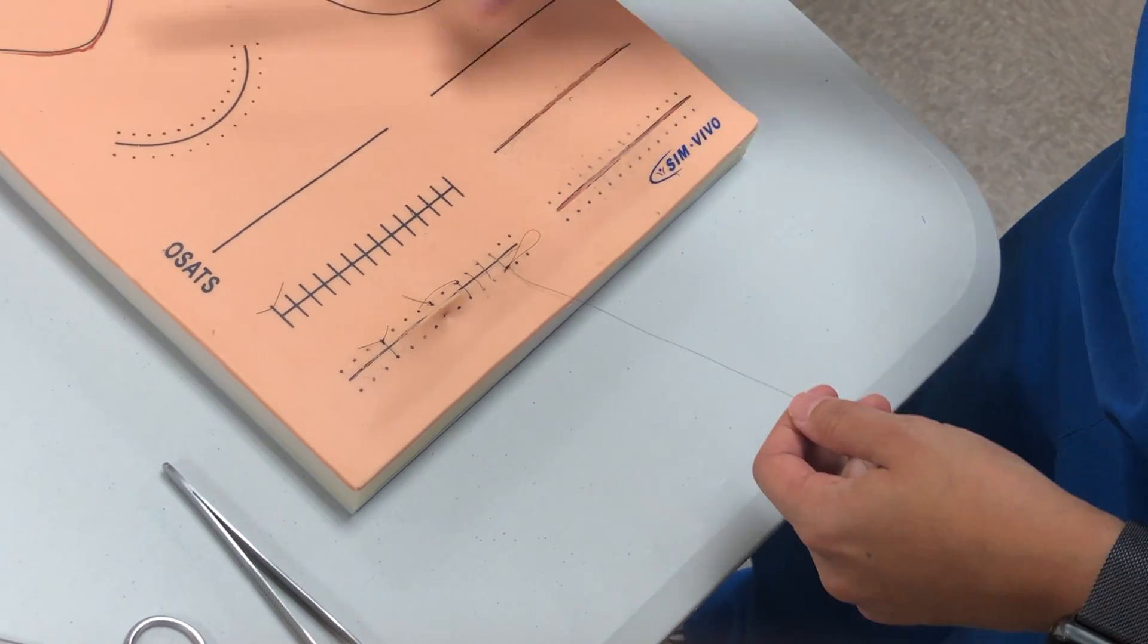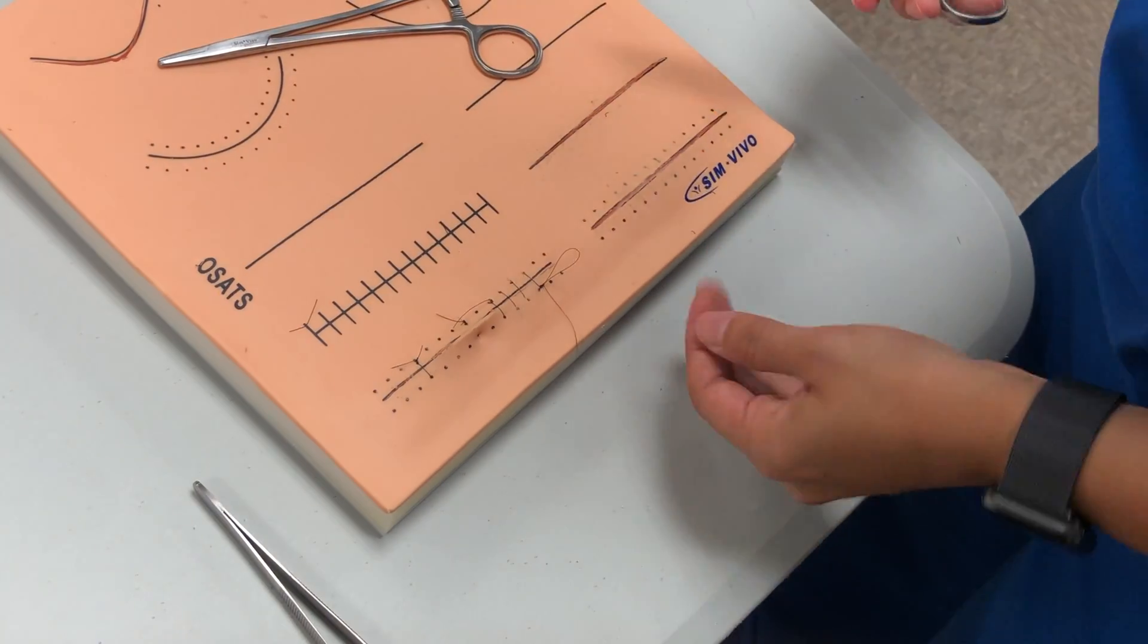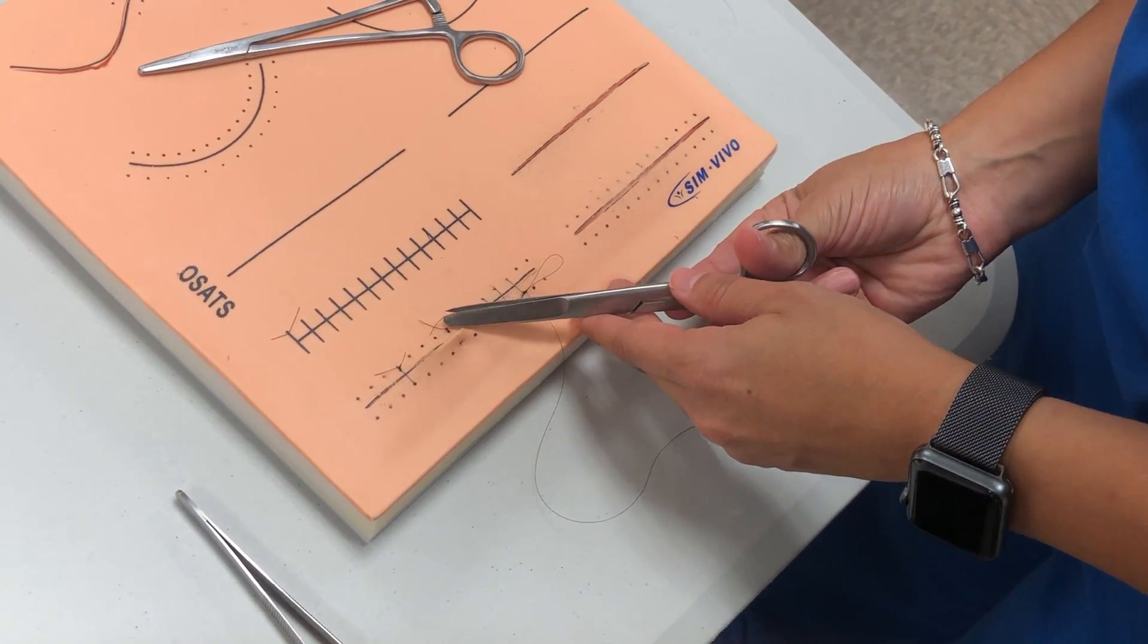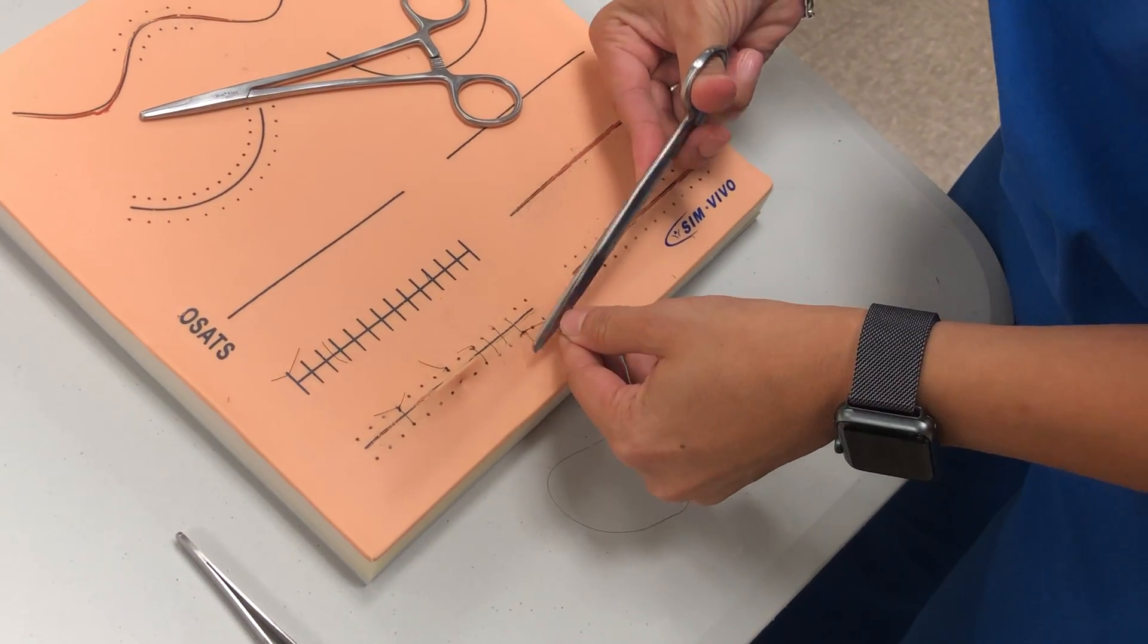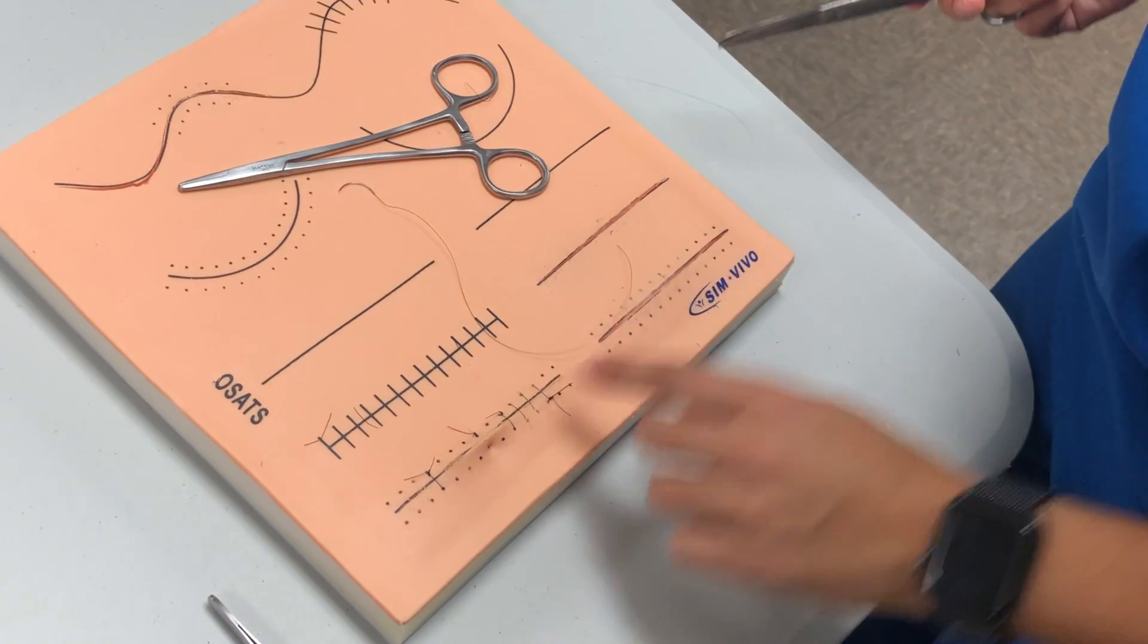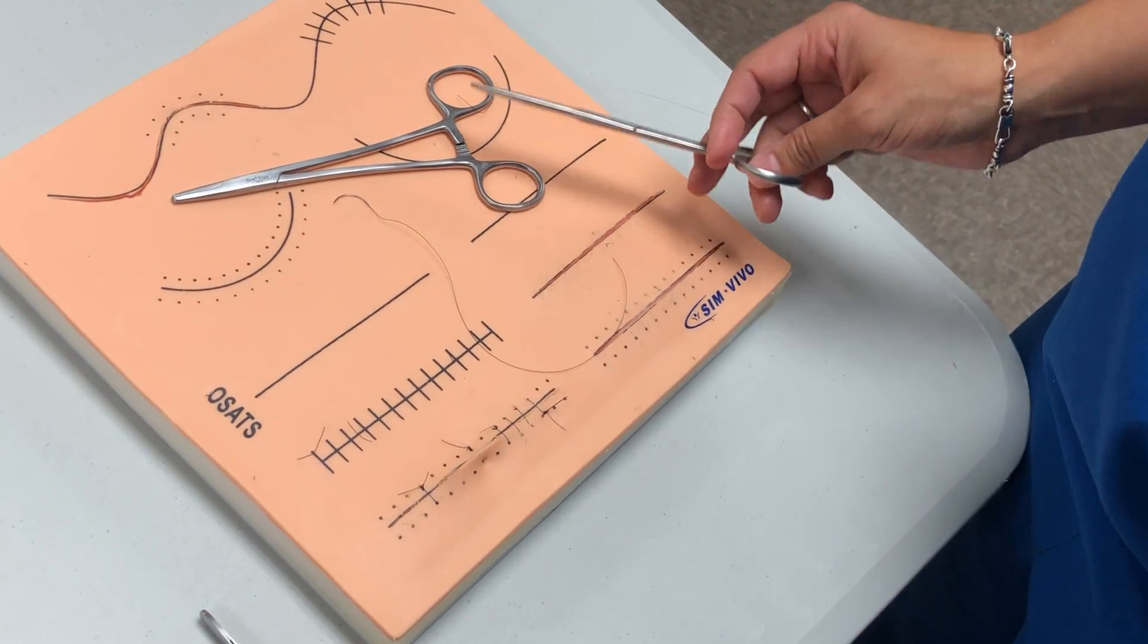Okay, and once I got that, then I'm going to cut my ends. I'll probably cut this one first. And then cut the three here. And there you go.